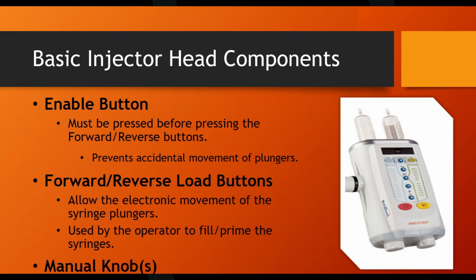All right, just some components on here. So right here, you notice we have my forward and reverse buttons. These are obviously there to move the plungers up and down. But you'll notice if I hit the forward reverse button, nothing happens.